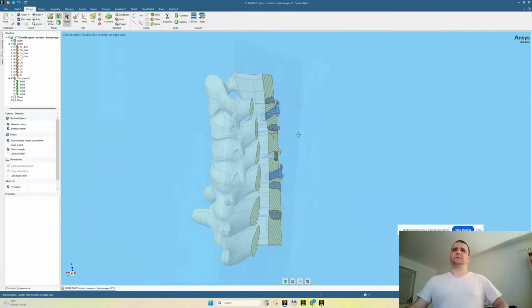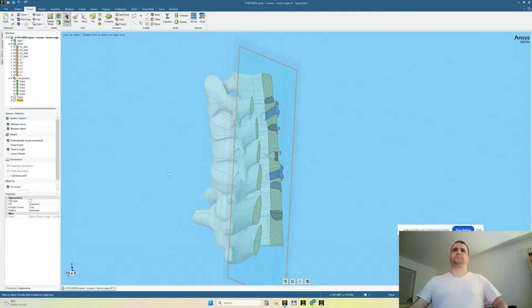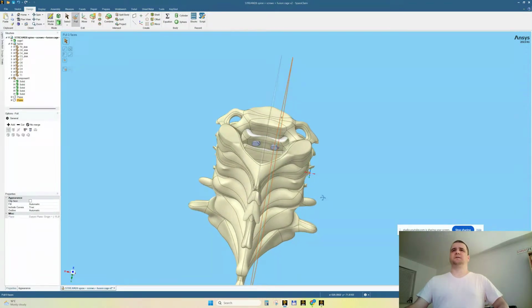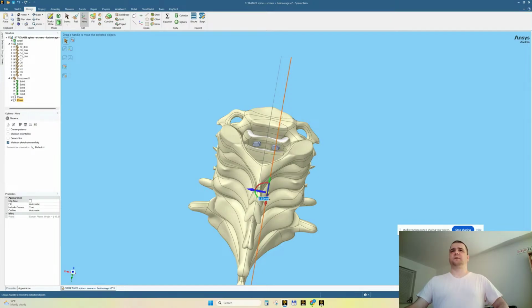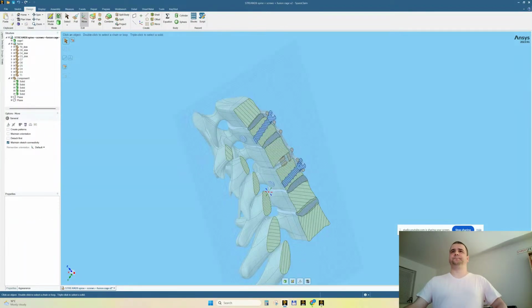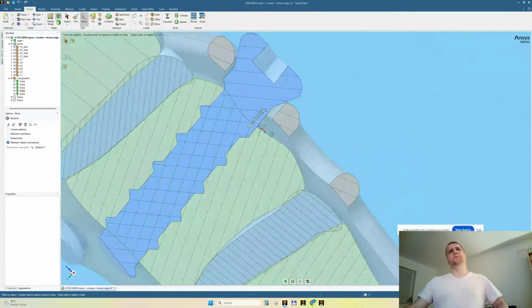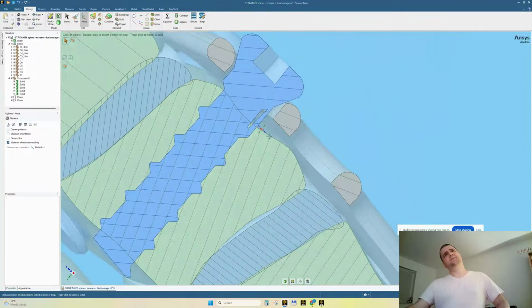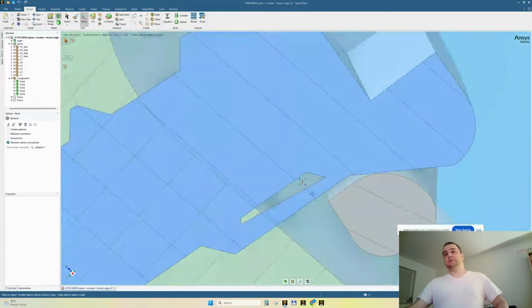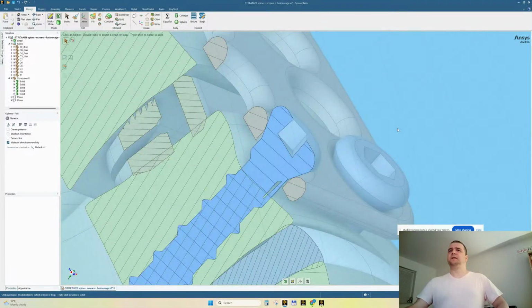We're going to skip the evaluation of the contacts. It's so much work. So now I get the what? The screws have design problems. Can I solve them? Let's see.